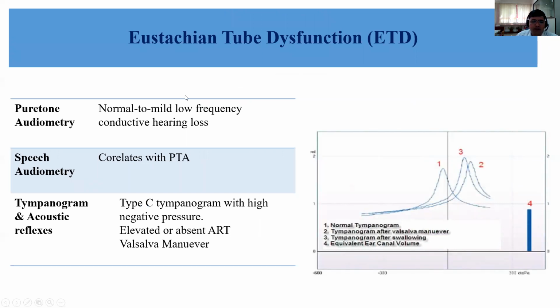Another important audiological assessment and clinical observation you must see is eustachian tube dysfunction. Most often you write patulous ET, that it is open most of the time. So what we do is, if the tympanic membrane is intact, there is one procedure to perform ET assessment. If the TM is perforated, there is another way of performing.